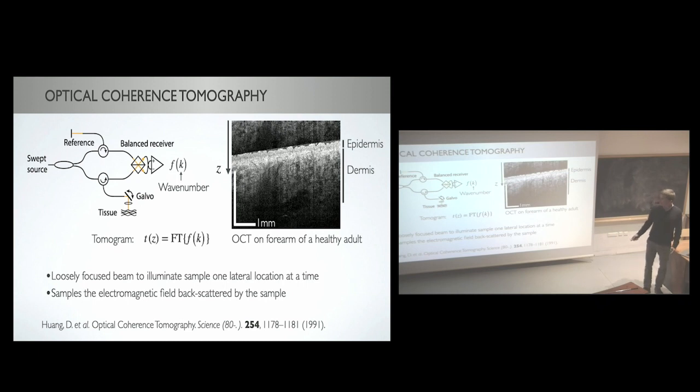In our development center, we focus more on endoscopic and fiber-based uses of OCT. So here is a simple schematic of a typical OCT system. We use a swept source, a wavelength swept laser source. A simple way to think of OCT is as the optical analog of ultrasound imaging. But because light travels much faster than sound, we need interferometry to measure the propagation time.